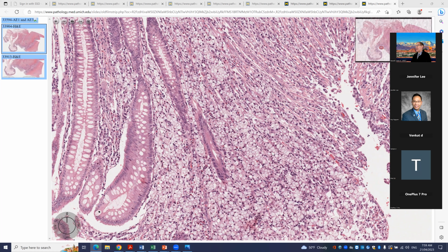I think the goblet cell adenocarcinomas usually have more defined areas of sort of structural mucin production in those lesions, and a little bit more of the goblet or of the carcinoid component where you may not have goblet cells, you may have small nests of tumor. But I think you really can't reliably do it without good evidence of immunohistochemistry. So I'm sorry that that's the case.